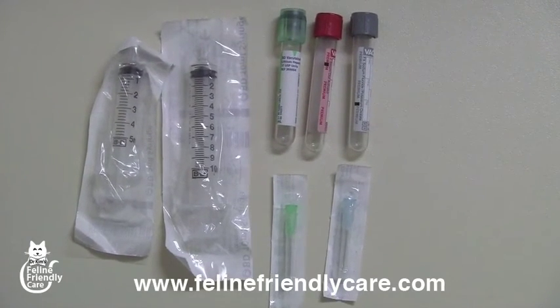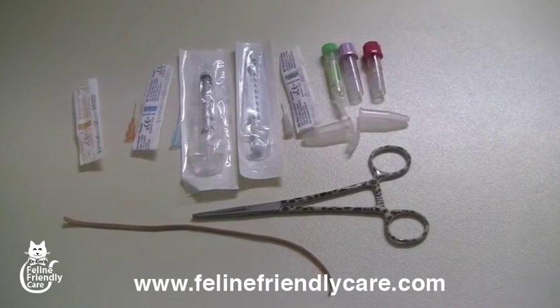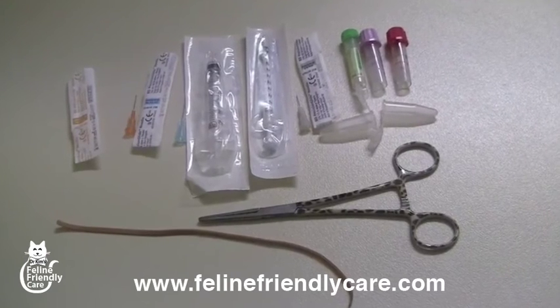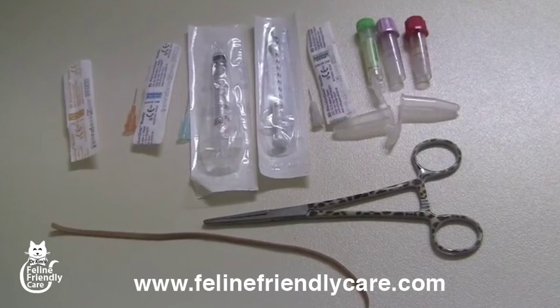So I refuse to be driven by the laboratory people. I get the sample tubes that are sensible for cats, and in fact they're pediatric. So a lot of the stuff for cats is actually pediatric use for kids, because it's hard to get samples out of babies as well.